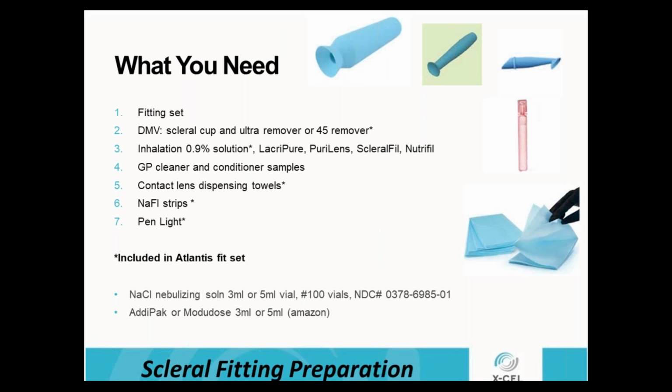that patient in there. Now, with us and our philosophy is we're always going to use a fitting set. And as we get more and more machines and devices that are measuring more and more area of a cornea and outside the limbal zone, we are getting better and better at first fit success.